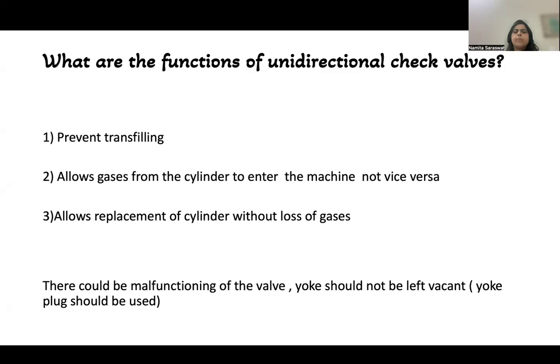However, there could be malfunctioning of the valve, so don't take it for granted. Always you can tell the examiner that the yoke should not be left vacant and a yoke plug should be used to prevent any mishap or loss of the gases from the cylinder, or to prevent transfilling.